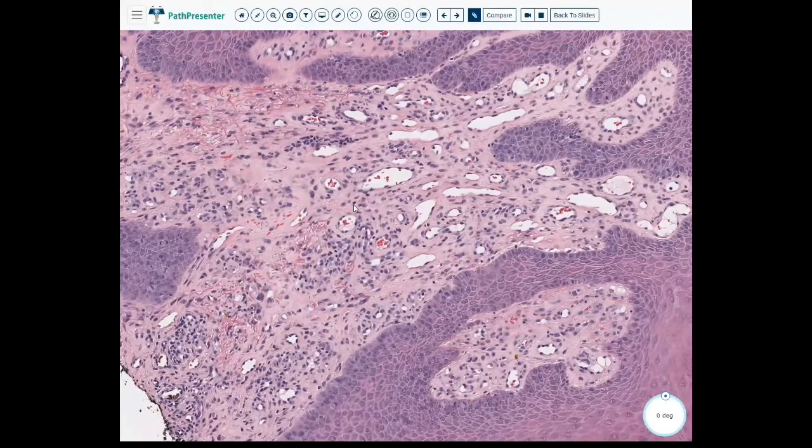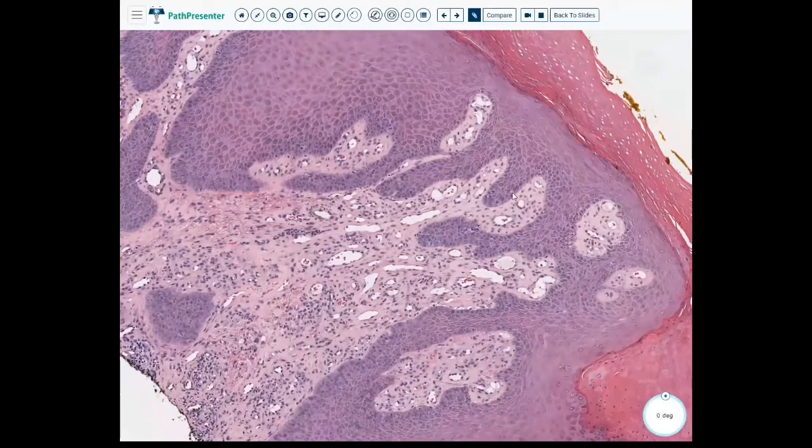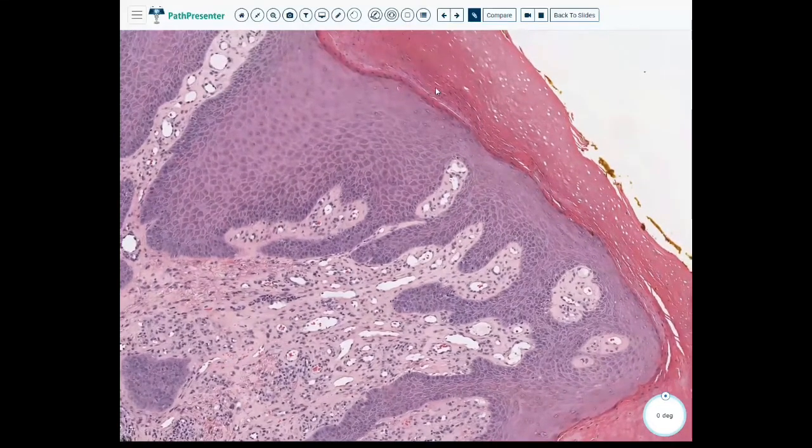They're not forming a lesion themselves, so we're not worried about whether this is a plasmacytoma. It's just a very large sprinkling of plasma cells within the dermis. So that's dermal plasmacytosis. But the lesion itself, with all these fibrotic papillae and dilated vessels, the acanthosis that's somewhat irregular, and the orthokeratosis and parakeratosis, this is lichen simplex chronicus with dermal plasmacytosis.